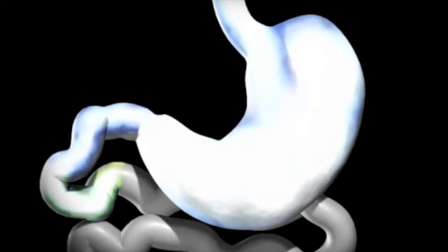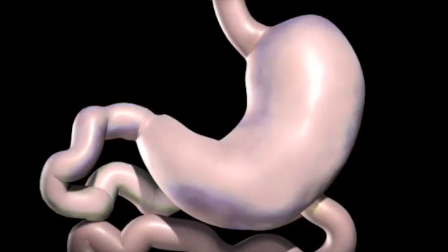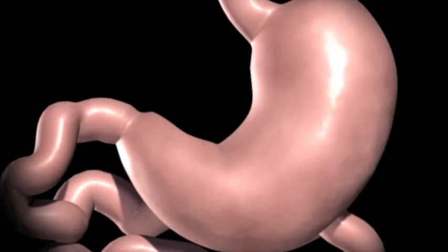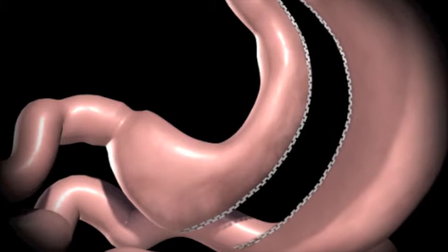Food is broken down into a simpler form so that it can be more easily digested and absorbed once in the small bowel. During a sleeve gastrectomy, a thin vertical sleeve is created by using a stapling device. This sleeve will typically hold between 50 to 150 milliliters.